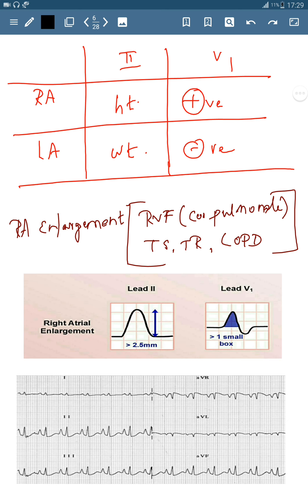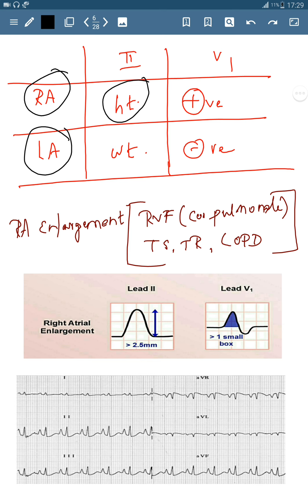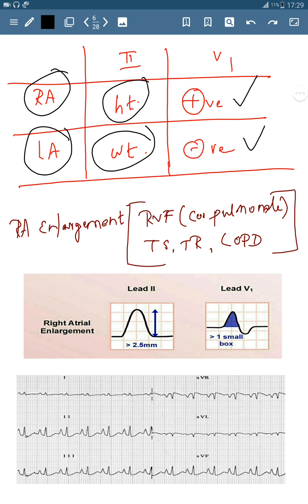Here is a small table to keep in mind. For the right atrium, look for height in Lead 2; for the left atrium, look for width in Lead 2. In V1, the right atrium will show positive deflection, and the left atrium will show negative deflection. Watch the previous video to understand why there is positive or negative deflection.